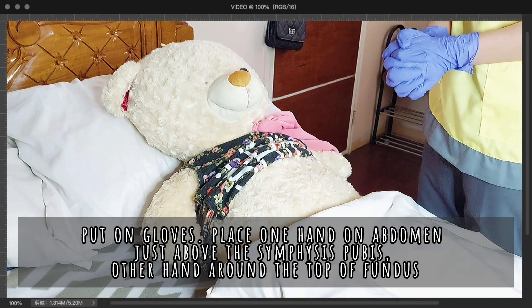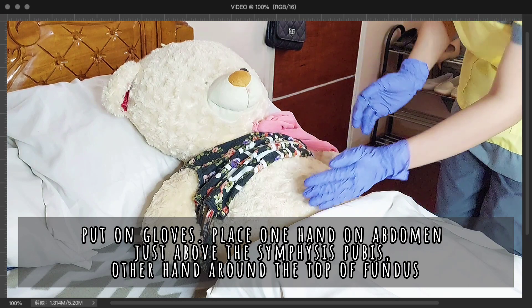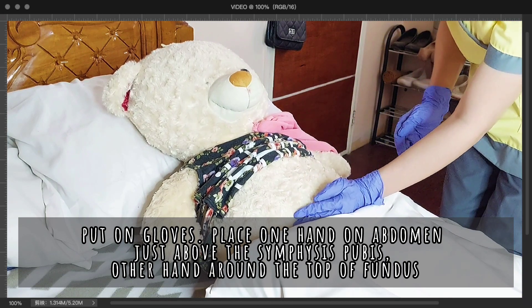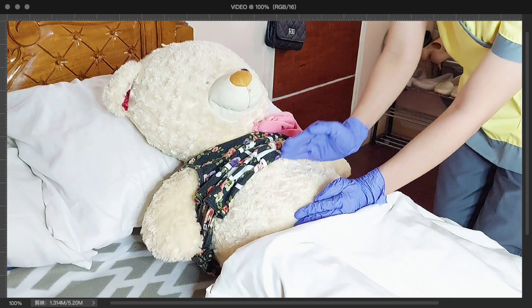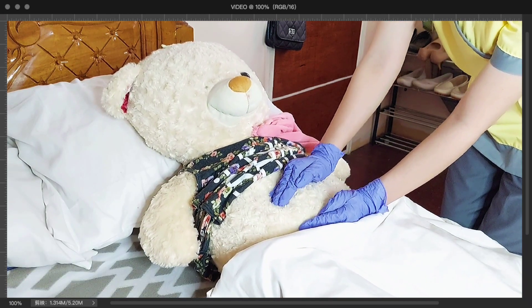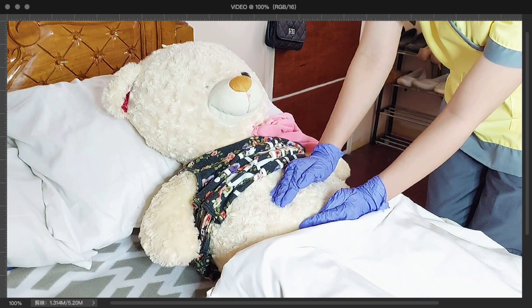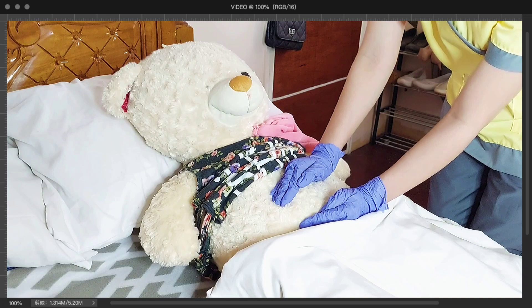I have already put on gloves. Ma'am Max Payne, I am now going to start massaging your fundus by placing one hand on your abdomen just above your symphysis pubis while the other hand is on top of your fundus. This will encourage the lower uterine segment and allow me to locate and assess the fundus.